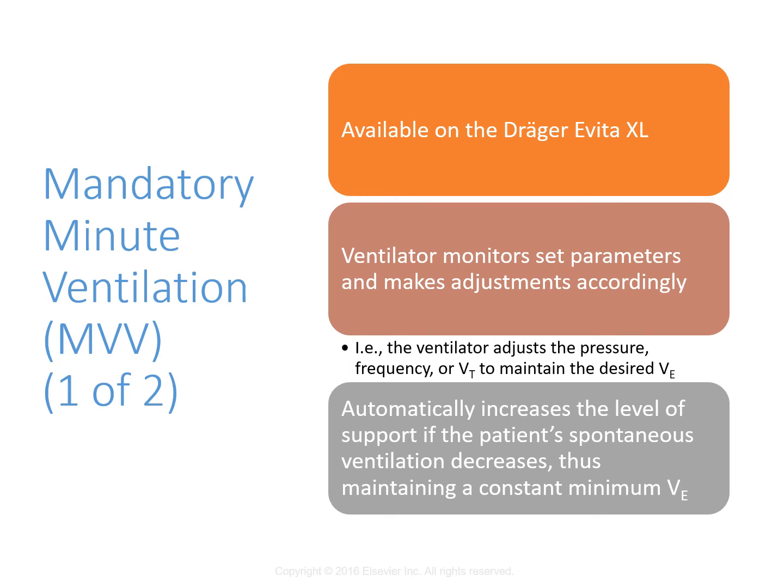The target minute ventilation, when you're using this, you set a target minute ventilation slightly below the patient's total minute ventilation. So this includes both their mandatory and spontaneous breath. So if a patient's on CMV, and they're not hypocapnic or alkalotic, then you could set it at 80% of the patient's previous minute ventilation level.